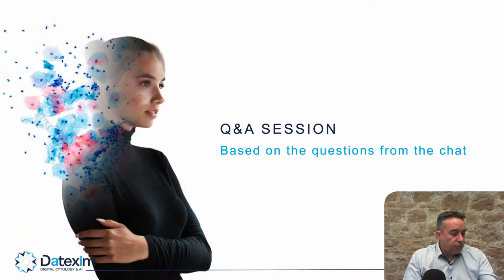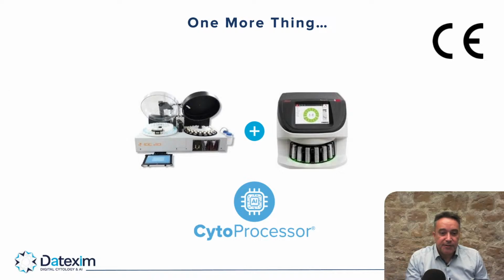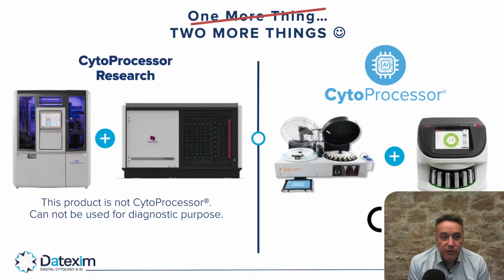So I think I will now, as you already saw because I spoke about it, it was my one more thing, a bit like Steve Jobs when he presents Apple things. So it's under the CE-IVD label, Leica GT450DX on the scanner, and we do even better because we have two more things to introduce to you, because we also release CytoProcessor Research, so it's not the same product. It cannot be used for diagnostic purposes for now. We are working on it.